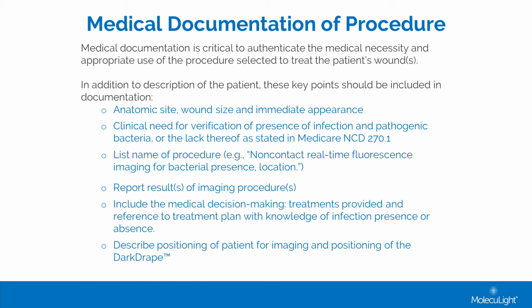You want to make sure you list the name of the procedure. Quote, non-contact real-time fluorescence imaging for bacterial presence of your anatomic location. You want to report the result of the procedure. Say, red fluorescing bacteria or red and cyan fluorescing was imaged on the wound. You want to be very descriptive about what you see.